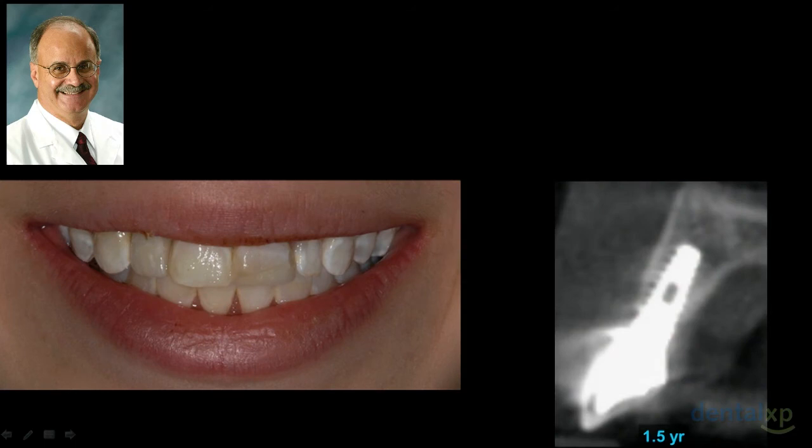And most importantly, we have a system of metrics for the first time as of 8+ years ago to evaluate that labial plate ongoing. Is it really still there? As you'll see, those of you that come to the corporate breakout this afternoon, I'll show some before and afters of literally no labial plates at all in the aesthetic zone. And we can regenerate those without membranes, only mineralized allografts and connective tissue grafts. Those are the type 3 defects, as Dennis showed, that we will work with.